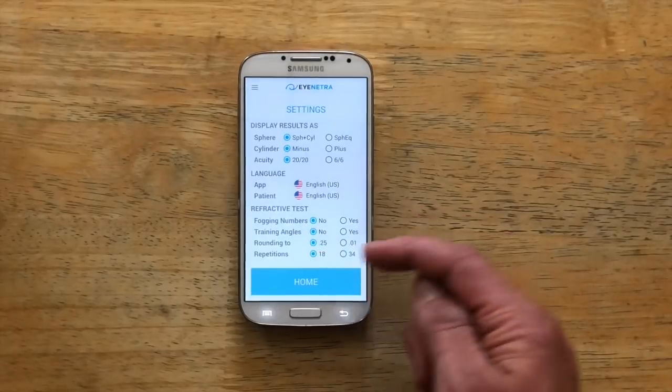Lastly, we have Repetitions. If you don't have this feature yet, you may need to update your app — go into the Play Store, search iNetra, click on the Netra app, and click Update; it takes about 30 seconds. With this feature you can now choose between the standard 18 or the new 34 repetitions option. Selecting 34 reps means the patient performs more repetitions, which increases reliability and precision. This mode takes about 50% longer than the standard 18, but if time is less of a factor, the 34-repetition mode can really improve the reliability and stability of your Netra results.